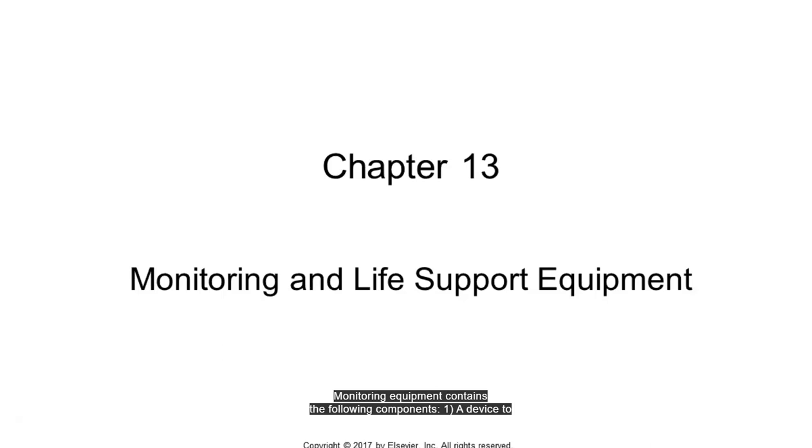Monitoring equipment contains the following components. 1. A device to detect the physiological event. 2. An amplifier to increase the magnitude of the signal from the sensor. And 3. A recorder or meter to display the signal.